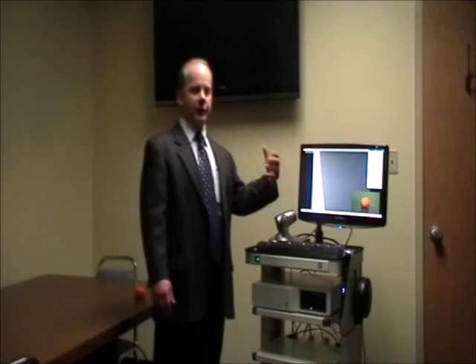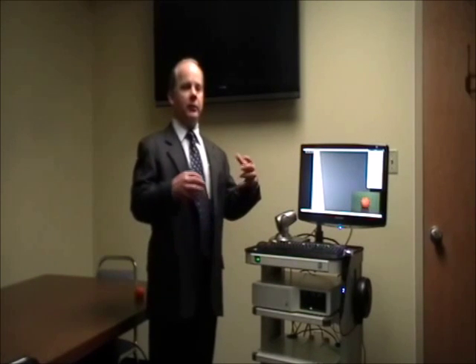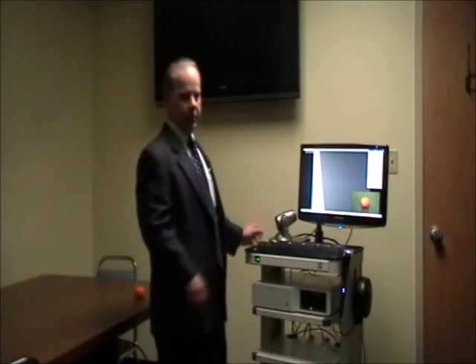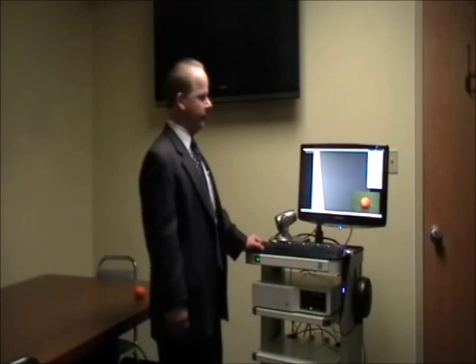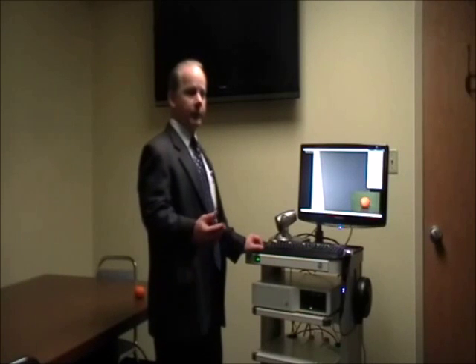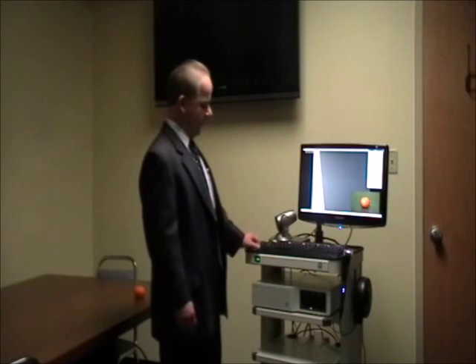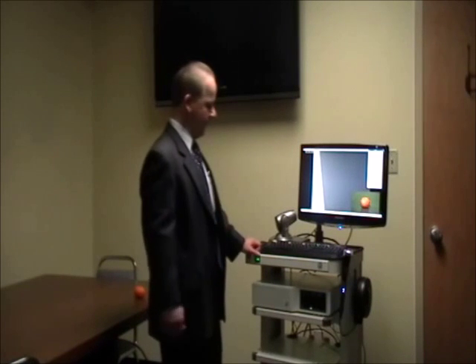So a remote specialist could actually be seeing real time in very high detail these exact same images that are being sent up by both cameras simultaneously, even from a PC that they simply use to connect via a web browser to the IP address of this device that's actually sending the images out live.